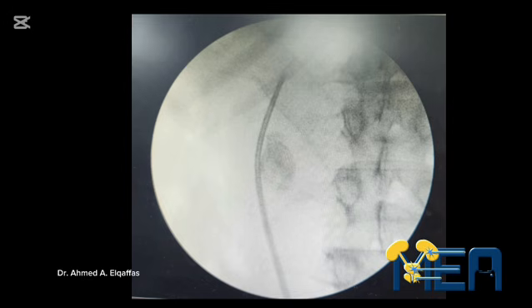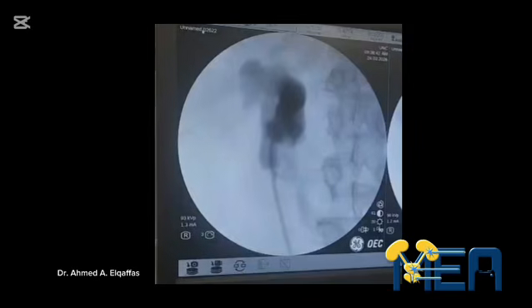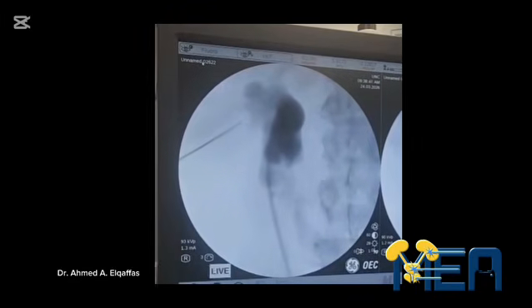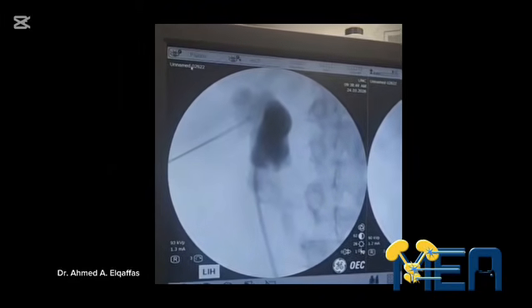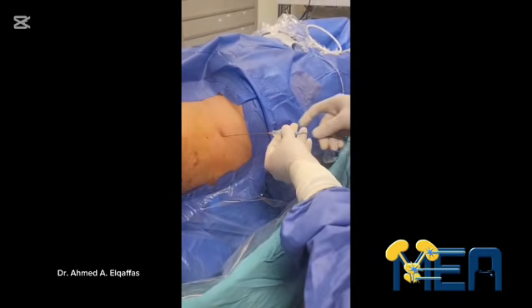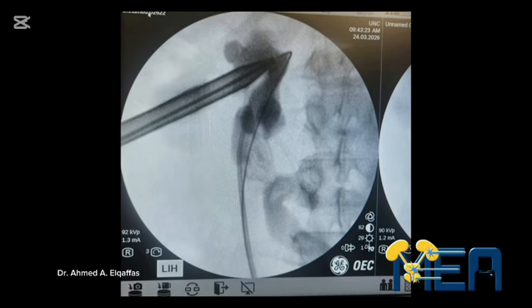Now, back to our case, we start by fixation of the ureteric catheter and retrograde pyelography. Retrograde pyelography shows the anteriorly malrotated system. The upper calyceal puncture is the targeted calyx in this case. Passing the J-tip guide wire in the ureter. Dilatation of the tract by single-step dilator.